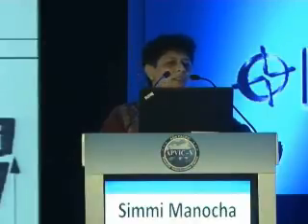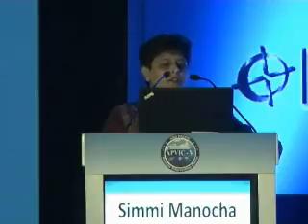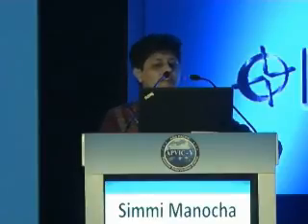Then there are various buttons for gain. Gain can adjust the acoustic power of transmitted signals. It also adjusts the amplification of returning acoustic signals. There are various machines which give us the option for near gain and far gain to adjust the amplification of returning signals at a specific image depth. Gain adjusts how the machine listens for the return of echoes. If we increase the gain, the strength of returning echoes is amplified, thus a brighter image.